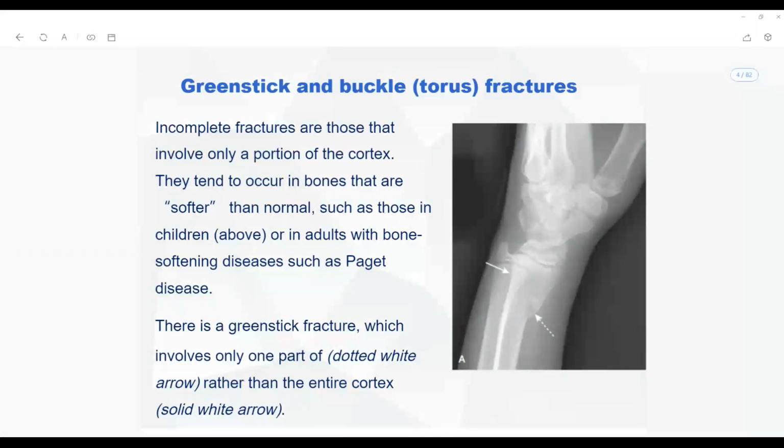Okay, right. The third rule is whenever a skeletal radiograph is taken, if it is related to the joints, first try to understand, then I will tell you the rule in a single sentence. Whenever you are looking for a joint pathology, for example, here I'm looking at the wrist joint. You see here, you have to include the bones proximal to the joint and distal to the joint. Okay, understand?